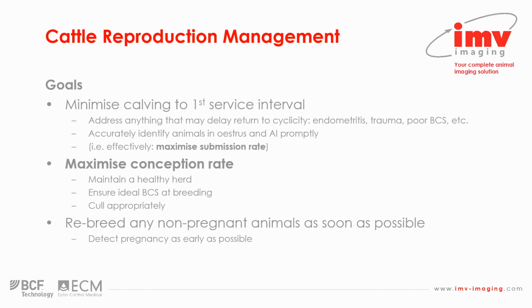And key to that is detecting pregnancy as early as possible, so we are then able to make a decision: don't rebreed this animal, maintain the pregnancy, recheck as appropriate, or make a decision: this animal is not pregnant and we need to get on with rebreeding her.